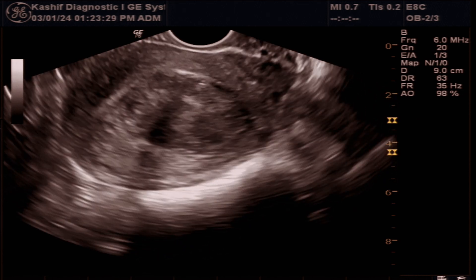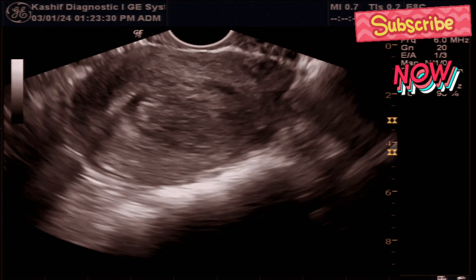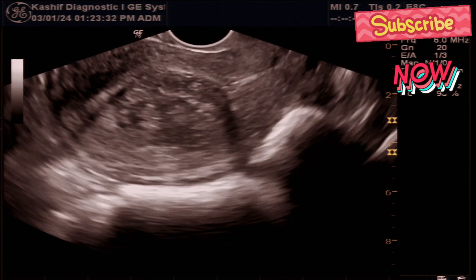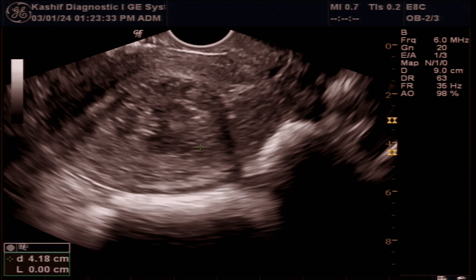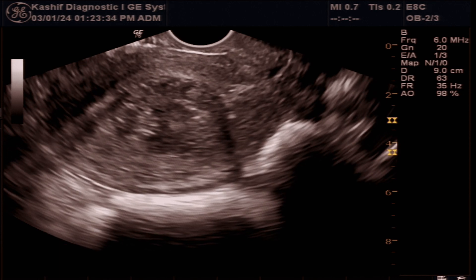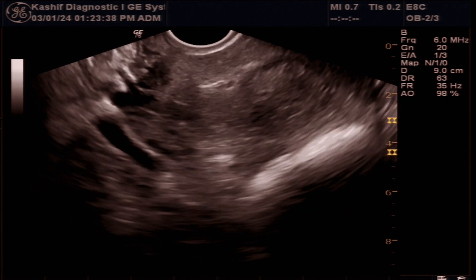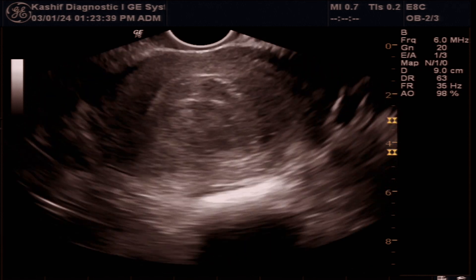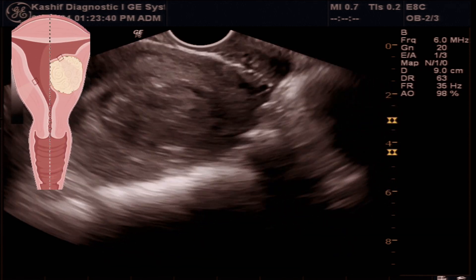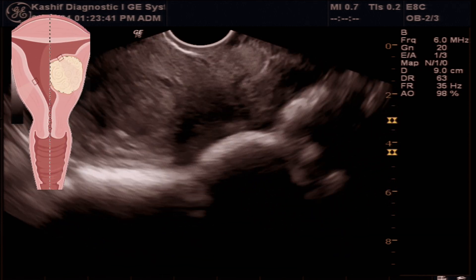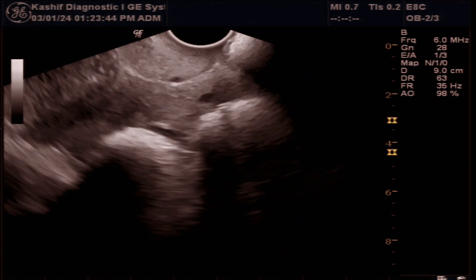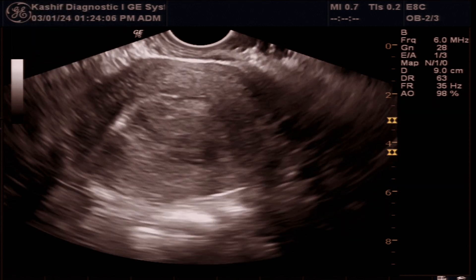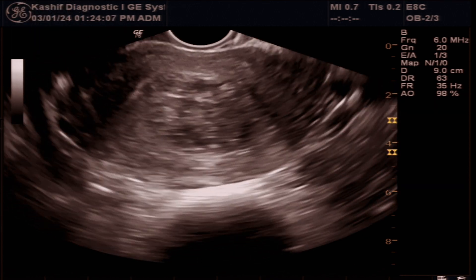Submucosal fibroids are the rarest among all other types of fibroids. Some submucosal fibroids can cause symptoms even when they are very small. They can distort the uterine endometrial cavity and cause bleeding problems as well as fertility problems.